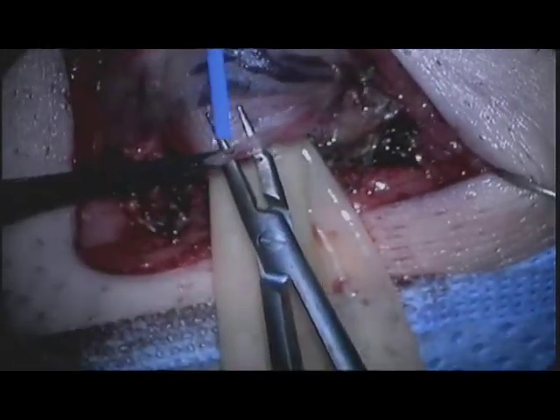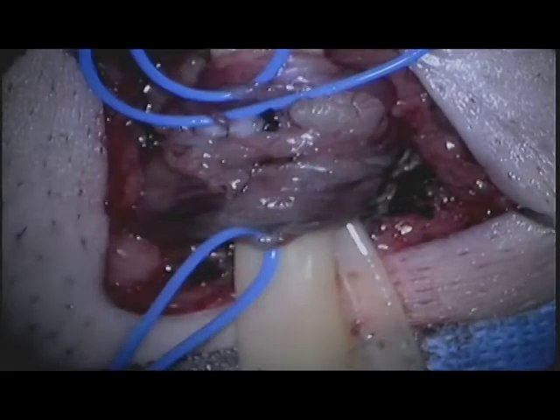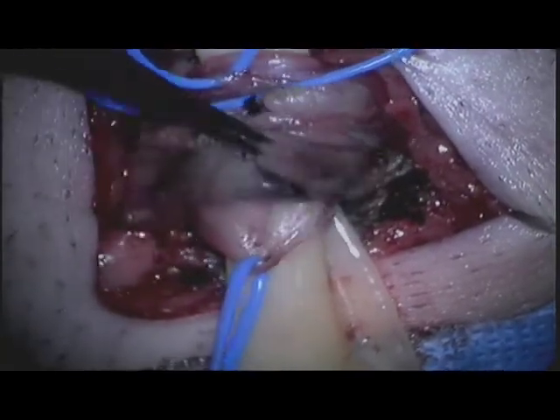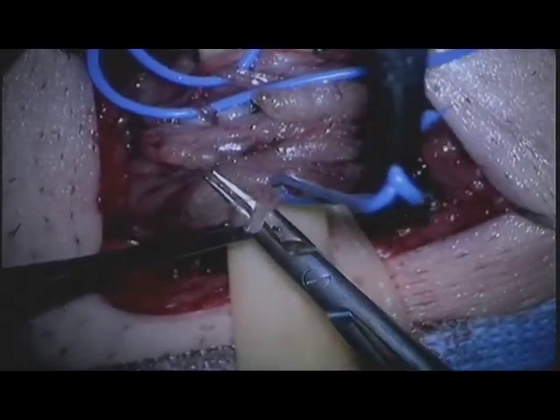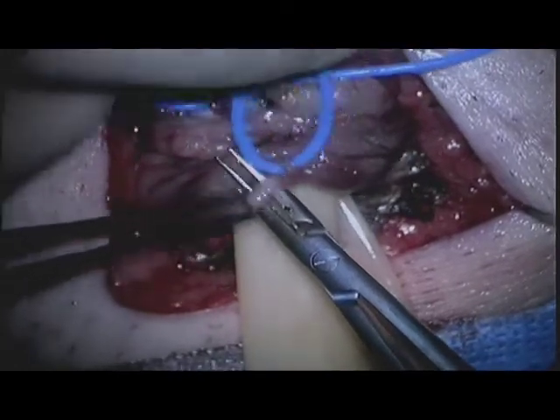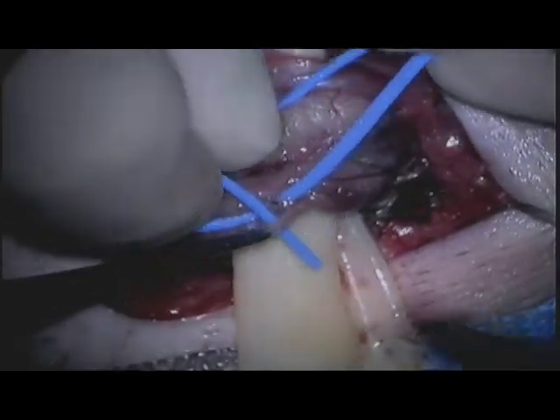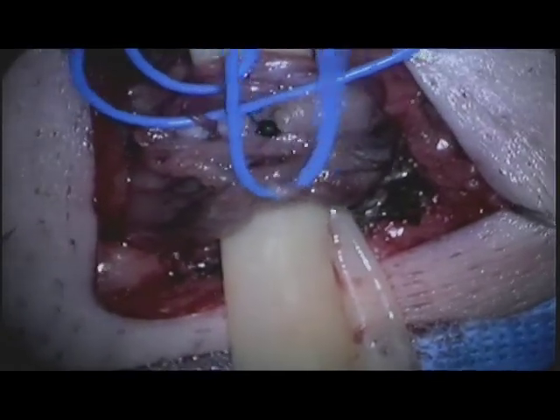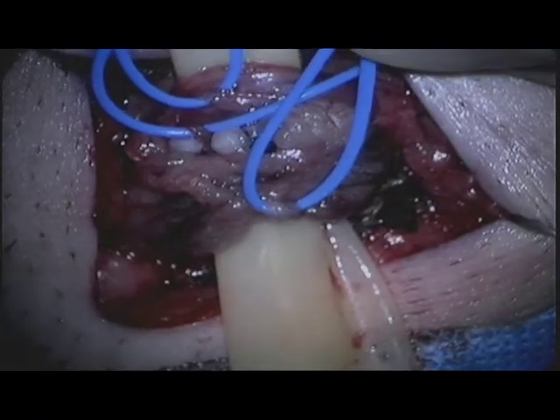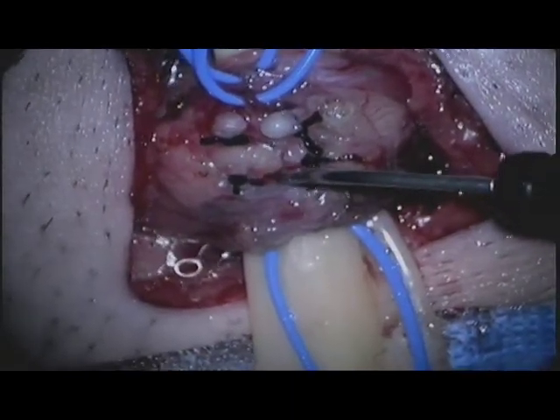Vessel loops are used to retract our key structures, such as these lymphatics, to aid in further dissection. Microdoppler is used to evaluate thicker cord structures such as this nest of venous vessels to allow for easier identification of the testicular artery.